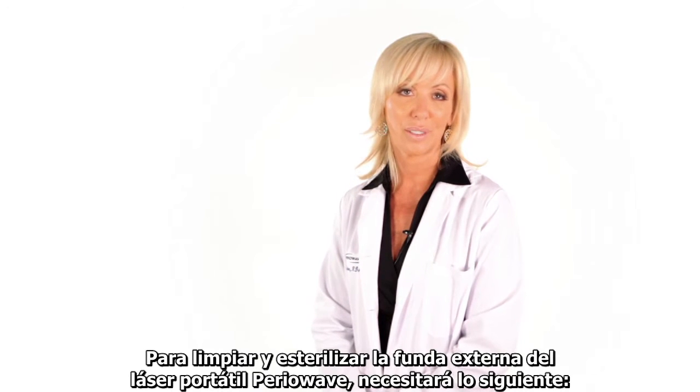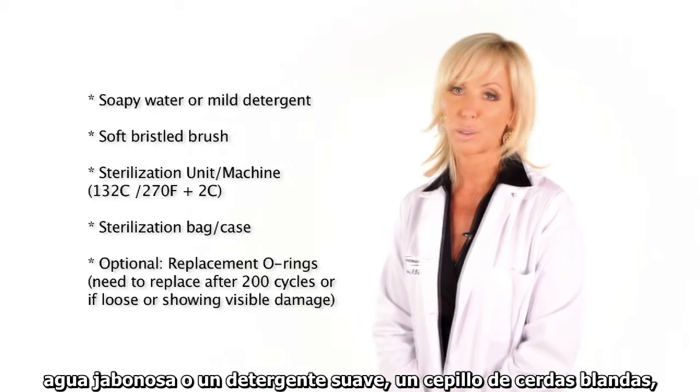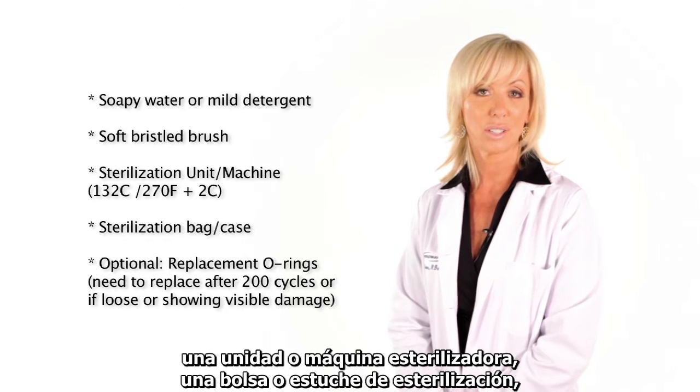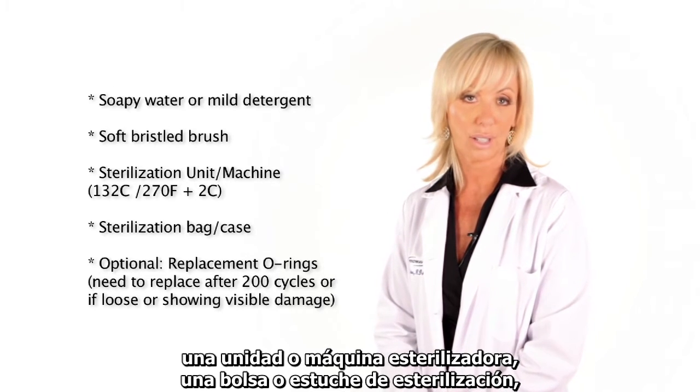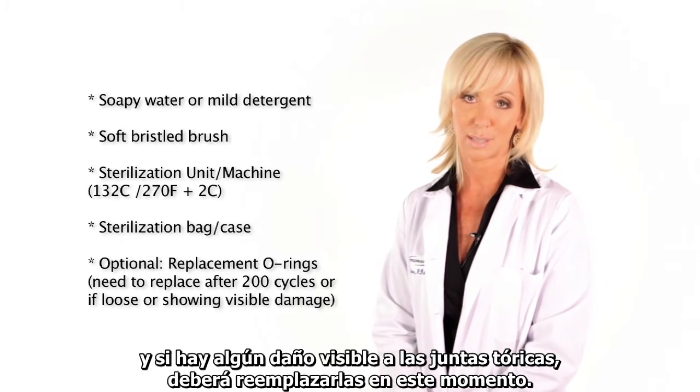To clean and sterilize your PerioWave handheld laser outer sheath, you will need the following: soapy water or a mild detergent, a soft bristled brush, a sterilization unit or machine, a sterilization bag or case, and if there's any visible damage to the O-rings, you'll need to replace them at this time.